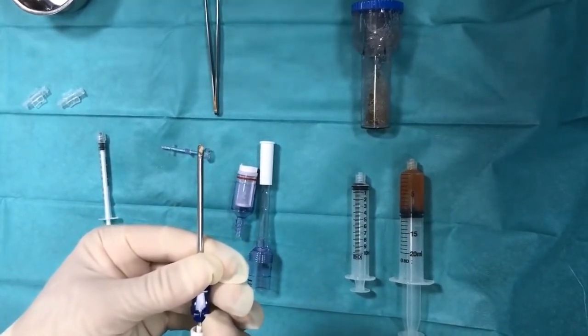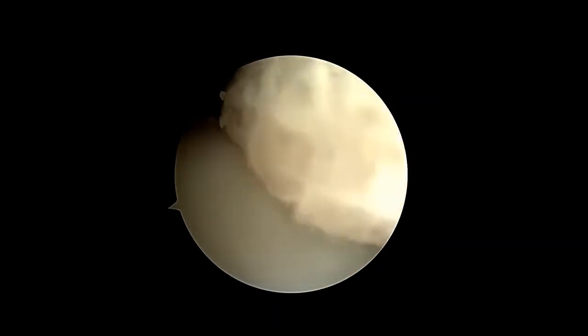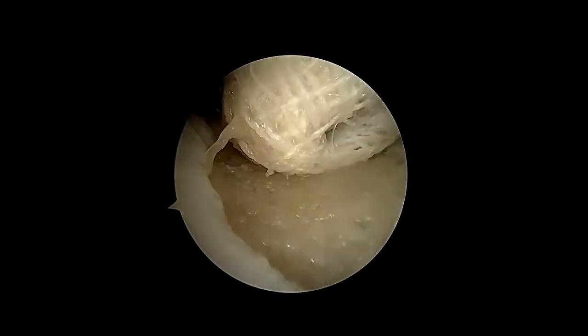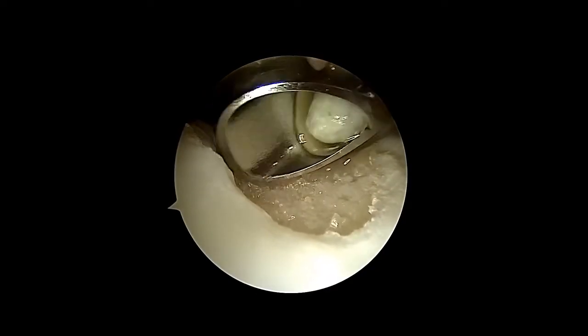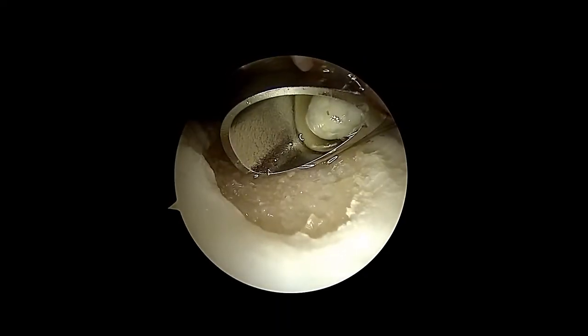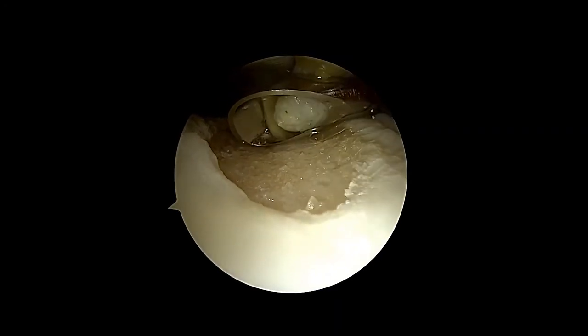Drain the water and dry out the lesion. Apply the minced cartilage into the defect by carefully advancing the trocar. Fill the defect only up to 80-90% to avoid shear stress.